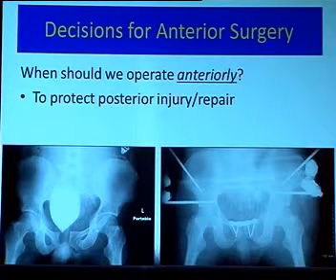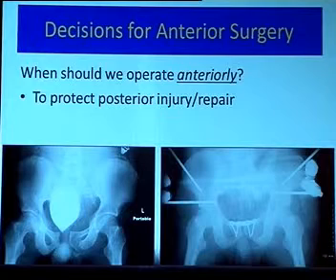The next reason to operate anteriorly is to protect the posterior repair. So as we saw from the second slide I showed you, that excellent strong posterior ring of bone, the arc of bone, the strongest bone in the body, where if it's disrupted, you know it's absorbed an enormous amount of energy.